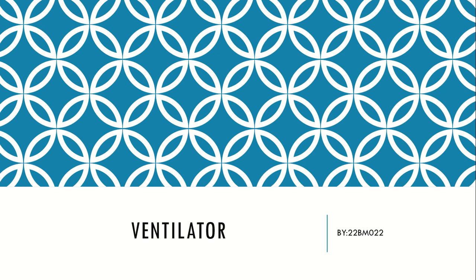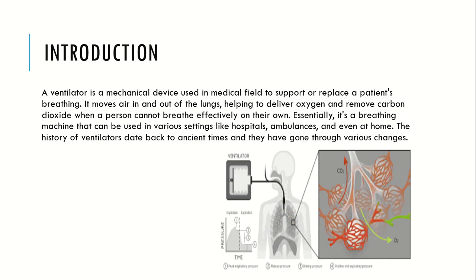The topic of the assignment that was assigned for me was the ventilator. So let's just start this introduction to the ventilator.